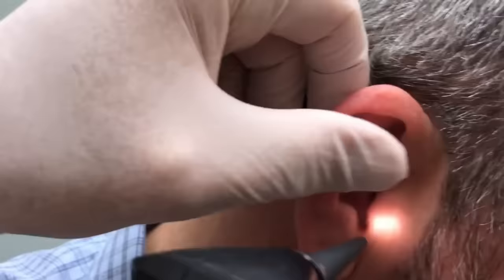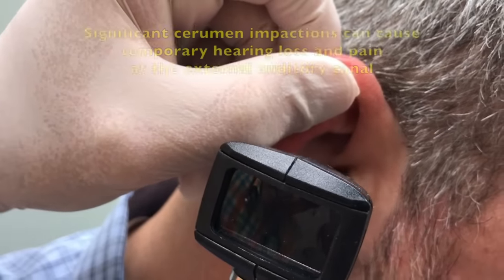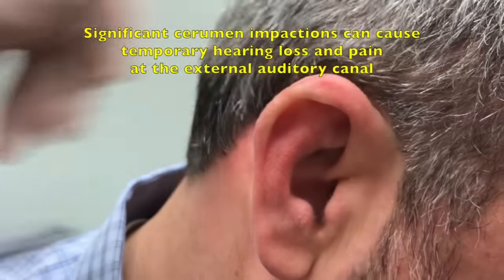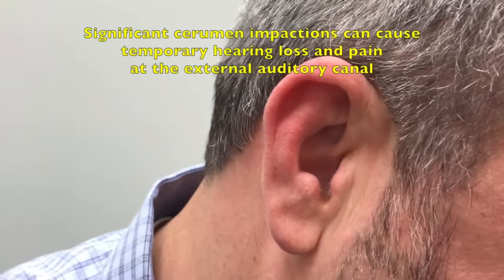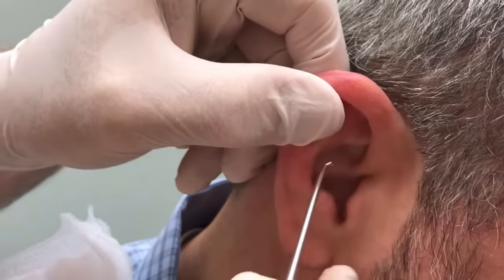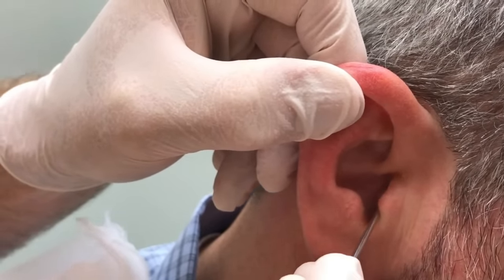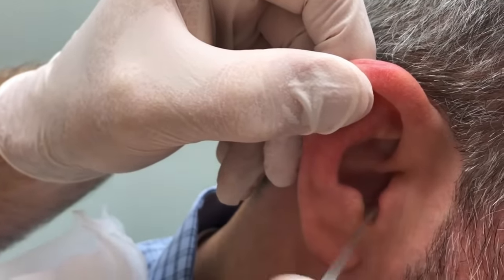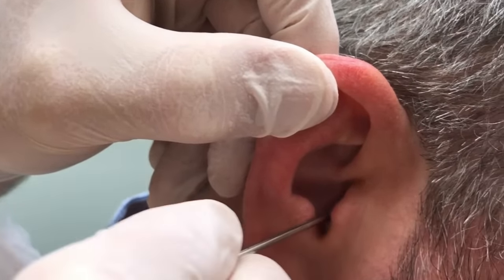Can you turn this a little bit right there? I'm going to take a look in there again. We're going to see if we can't get in there and get this for you. It's rather impressive. Well, my family's saying anything worth doing is worth overdoing. Alright, just hold it real still — if it hurts you're going to tell me. We're going to see if we can't gently get that out for you. You ready?